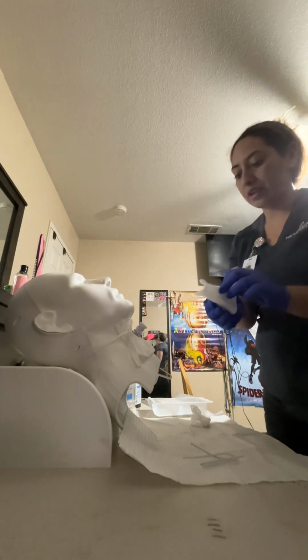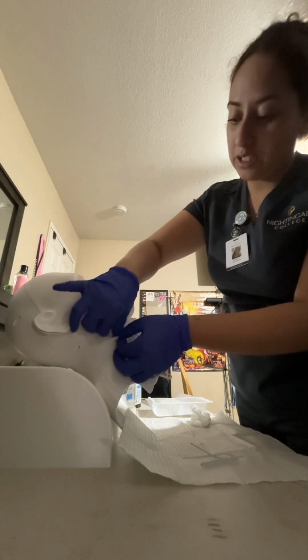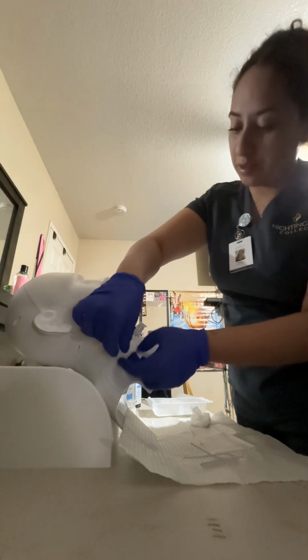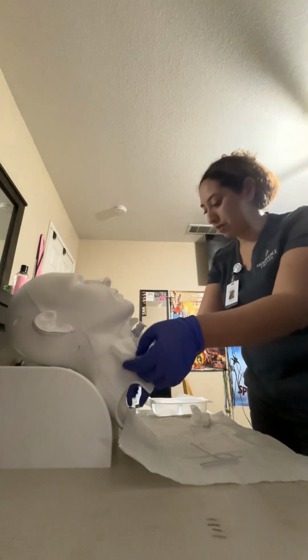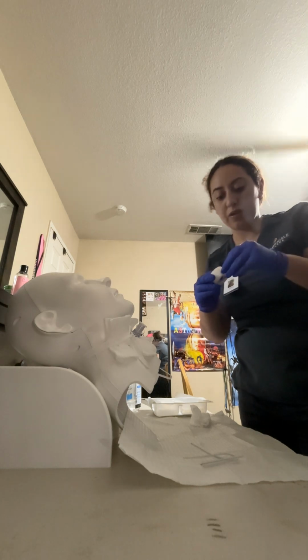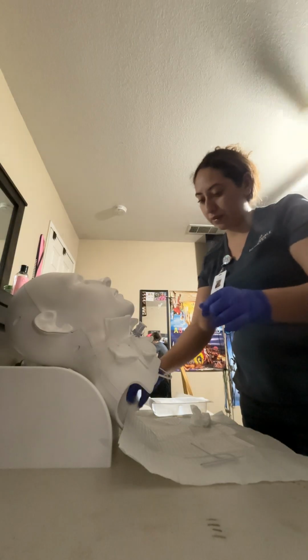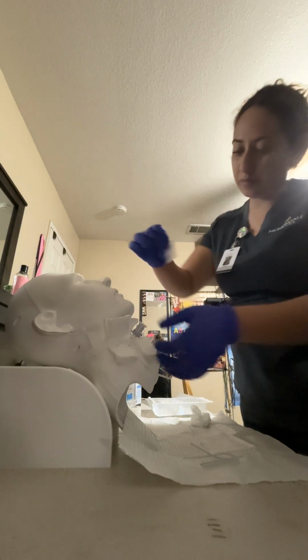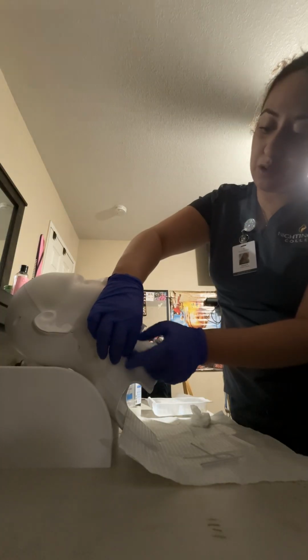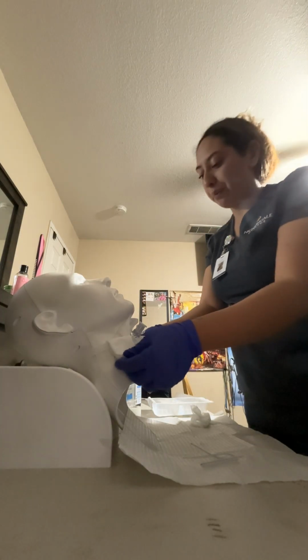I have another 4x4. We're going to place this here around that knot. We're going to fold that down, and with another piece of tape, we are going to close the end there. Okay, so now we have completed tracheostomy care.